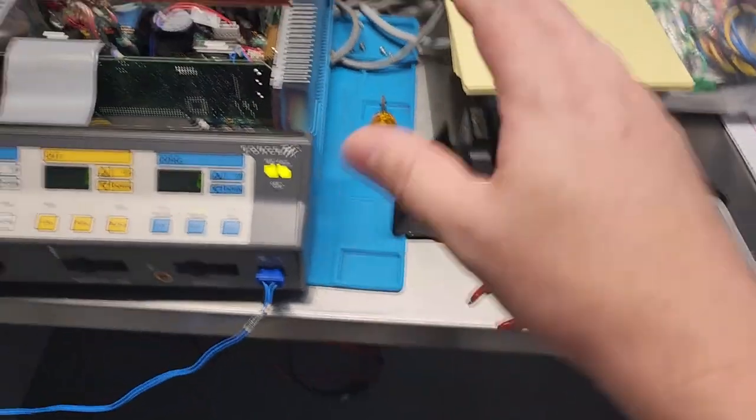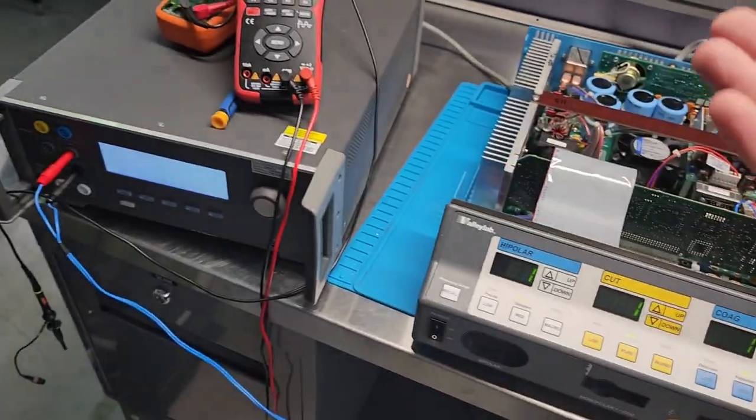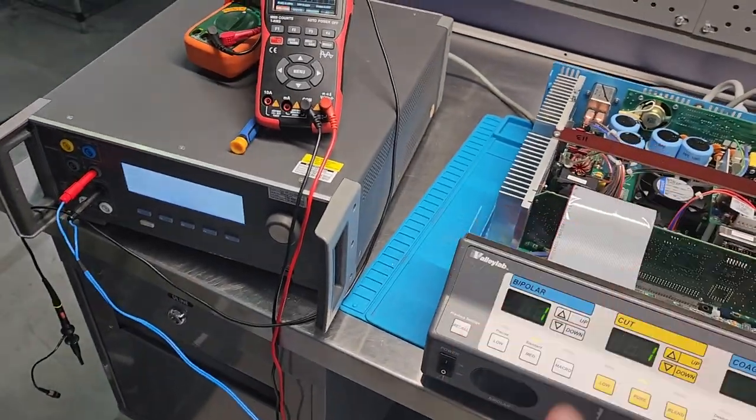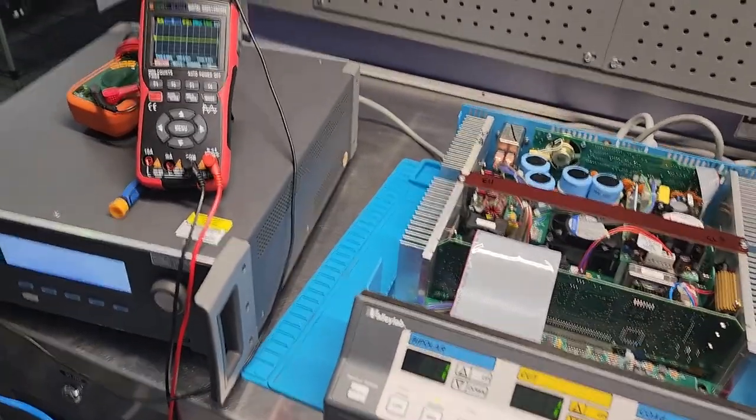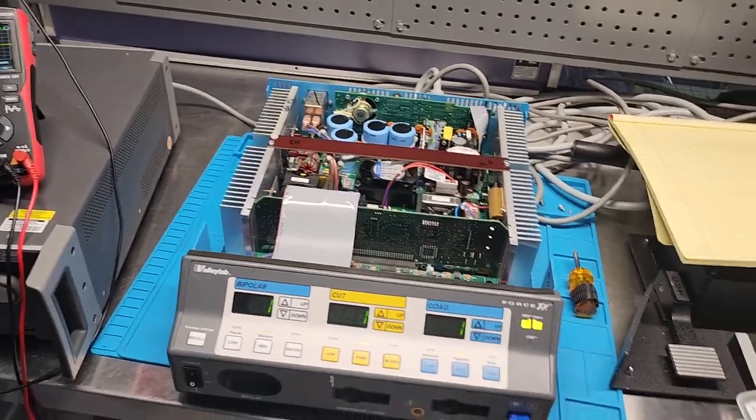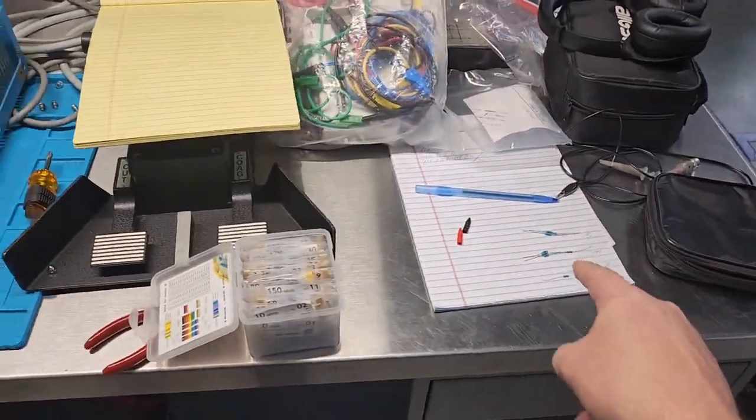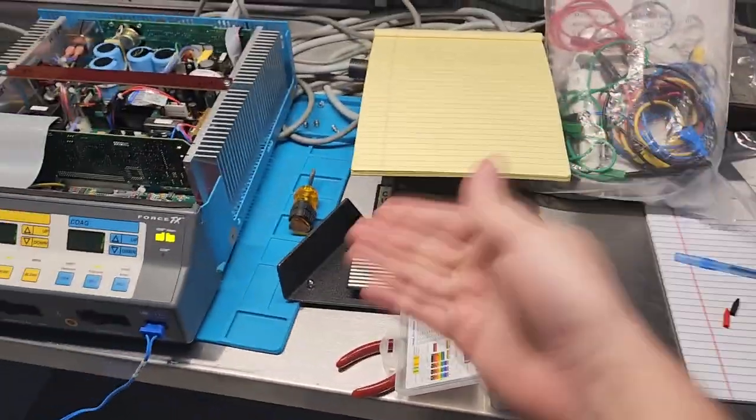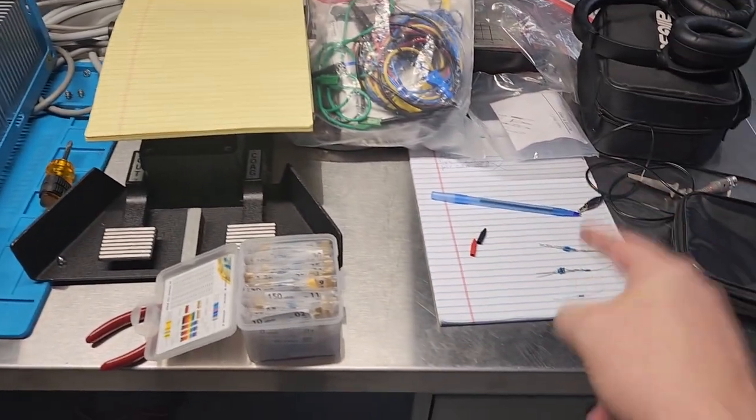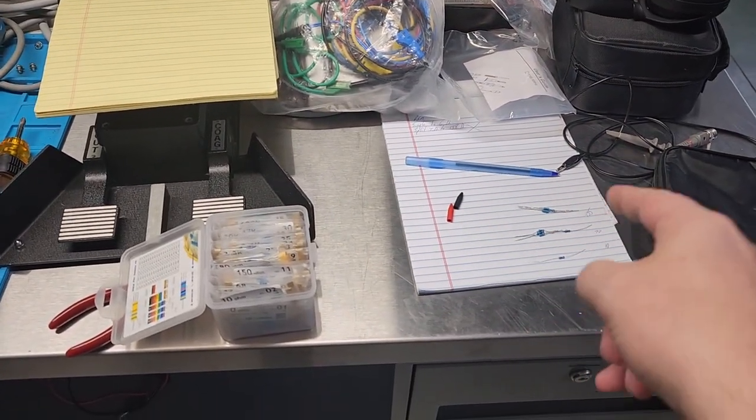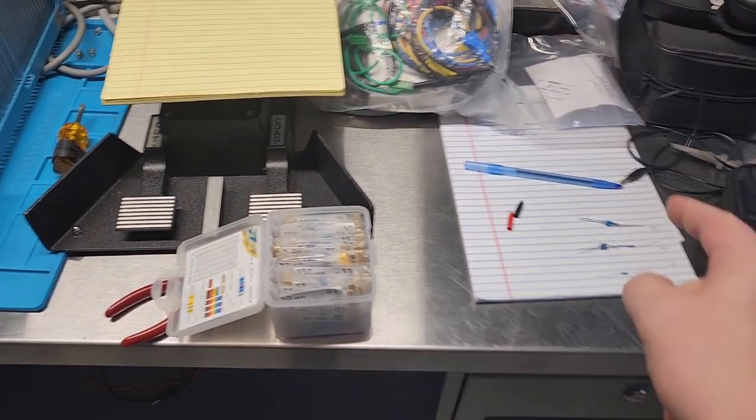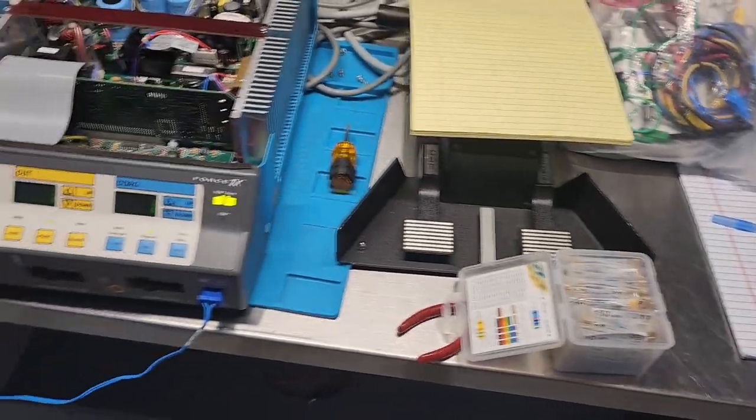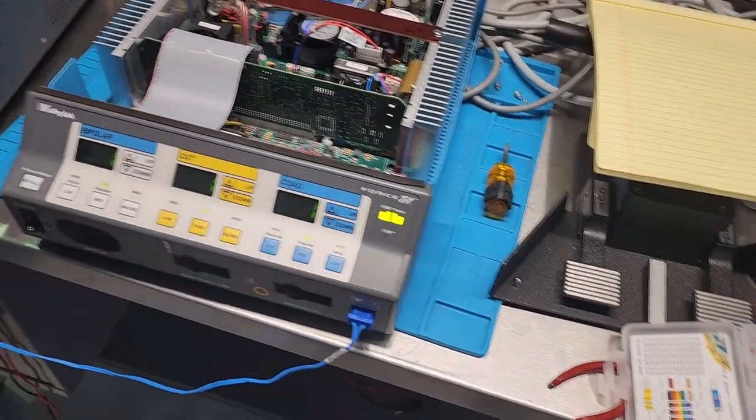But fortunately, I got this guy right here that can do it all in one, which makes it so easy. But just to be sure, because I was getting some really weird readings, I was resorting to using 1% resistors, which did not fix the problem, guys.